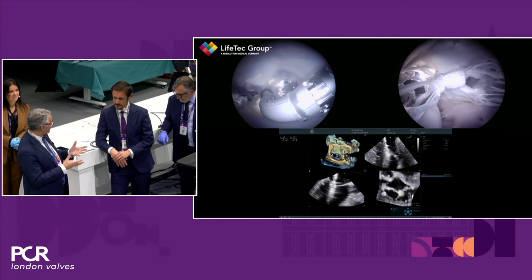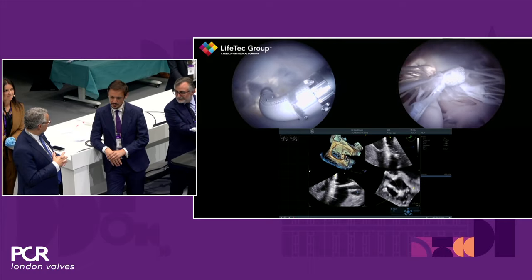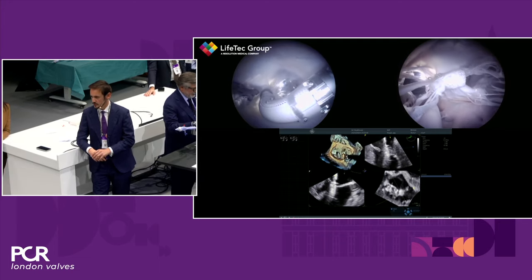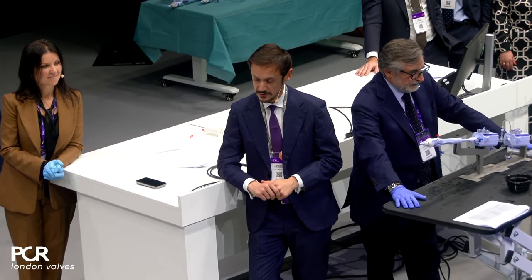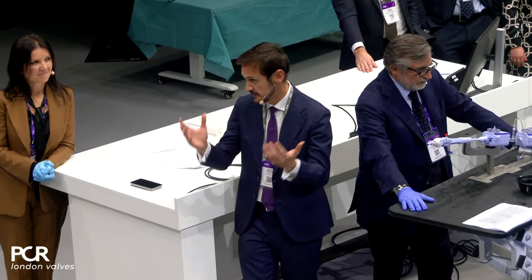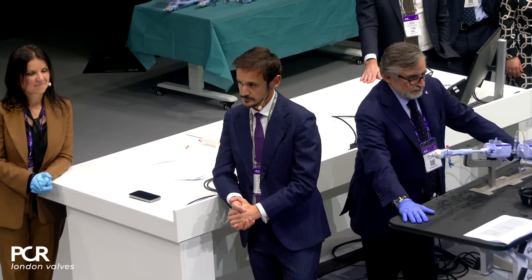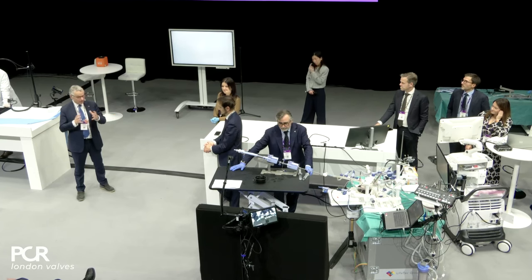And would you use a small clip, large clip, NT, NTW, XT, whatever? There is a lot of discussion. Many operators prefer to use, by default, NTW in ischemic MR. I'm not actually afraid of using an XTW if there is enough leaflet length and if there is no risk of stenosis. And so in a case like the previous one, I would probably have used an XTW. But I mean, NTW would work as well. And why do we discuss this? Because obviously clip device selection plays a role, particularly in FMR. I think it is an important discussion. We still have debate.